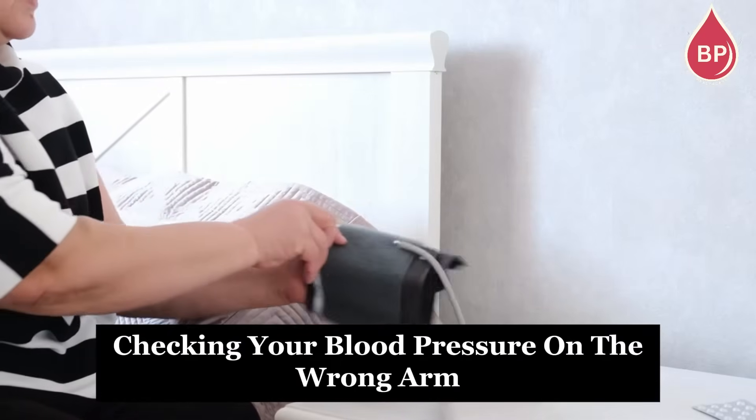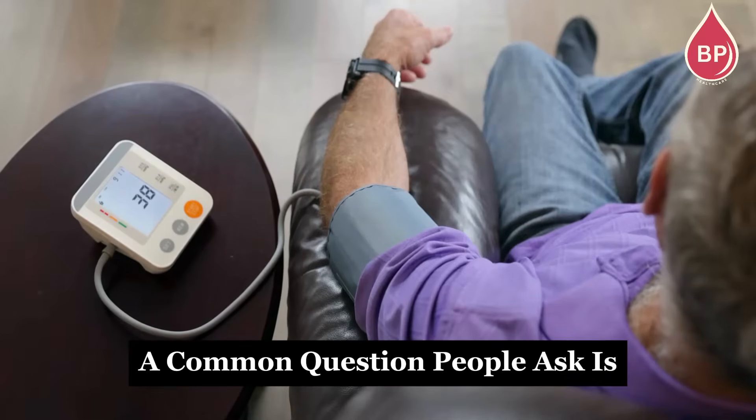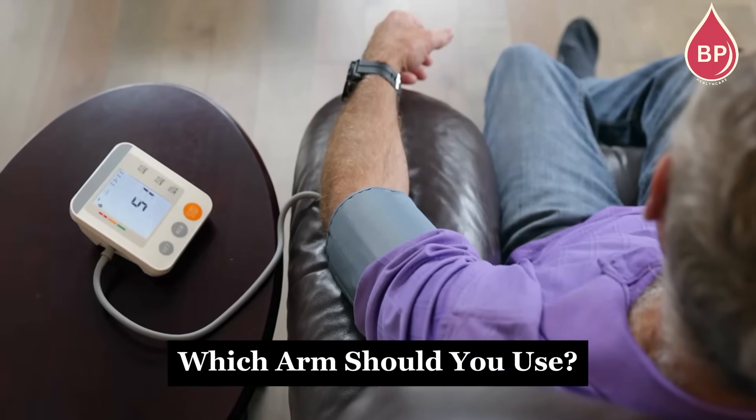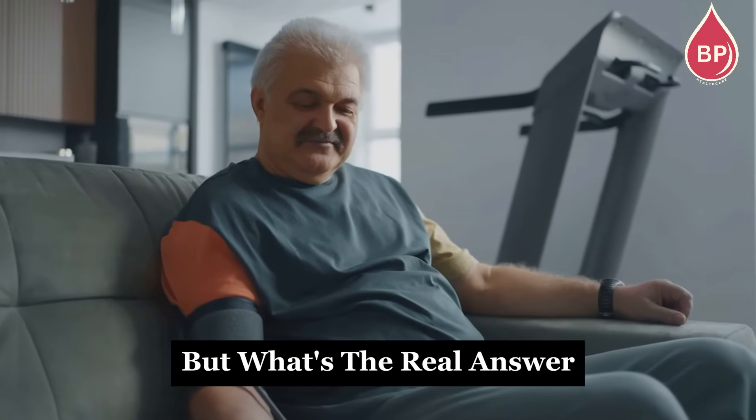Did you know that checking your blood pressure on the wrong arm could give you inaccurate readings? A common question people ask is: which arm should you use? Some say the left, others insist on the right. But what's the real answer?